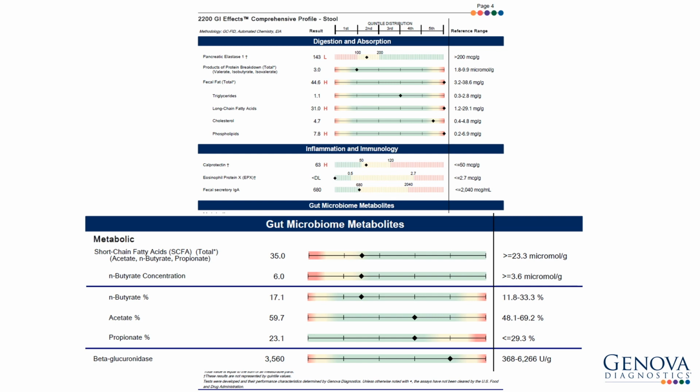The percentage breakdown of the 3 short-chain fatty acids is a percentage of the total short-chain fatty acids. These are made by different bacteria, and when there's an underlying bacterial imbalance, these percentages may also be imbalanced. So you want to address the underlying bacterial imbalance. In this case, they look balanced.